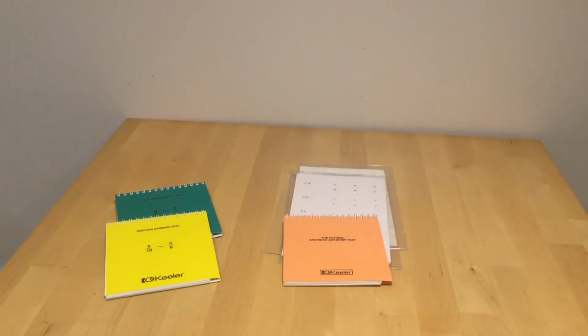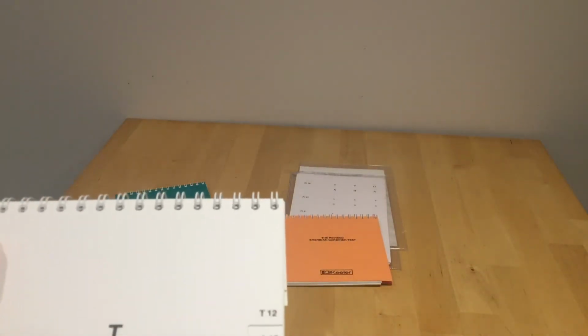If you have everything correct there, going well, we then move on to the next book, the yellow book, and we've got the values at 18. Let's have X, and there we go, and so on down to 6, T 6.